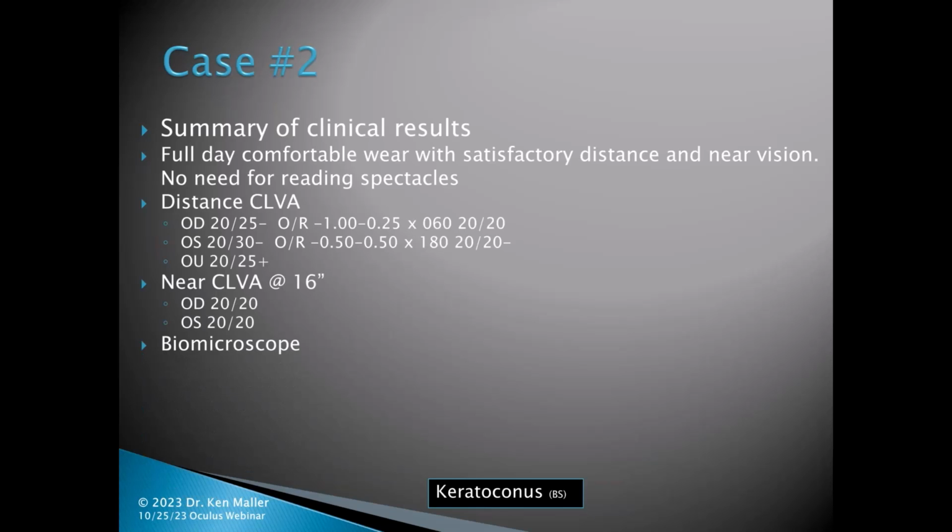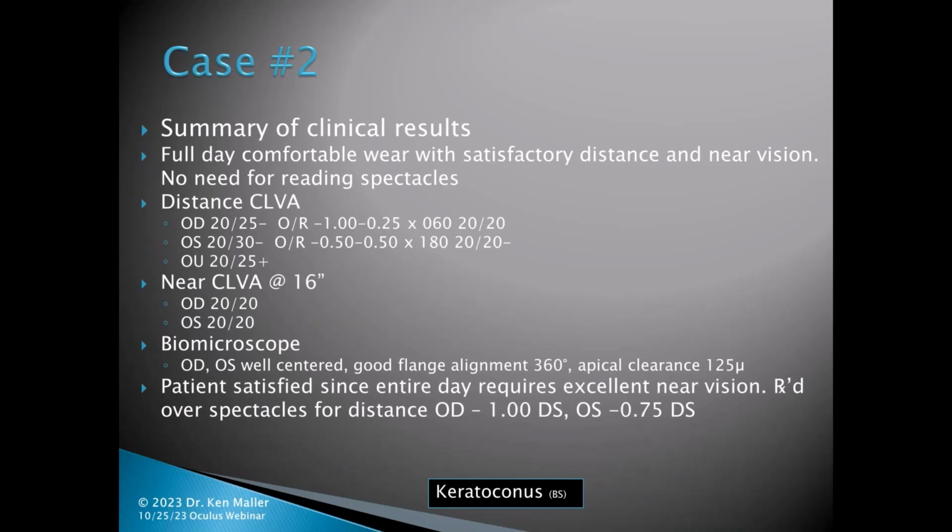She was 20/20 equivalent, monocularly, in fact. The fit of the lenses was well centered. They had good flange alignment, again, 360 degrees. We had apical clearance of about 125 microns on each. And she was incredibly satisfied all day long because she didn't need any reading glasses.